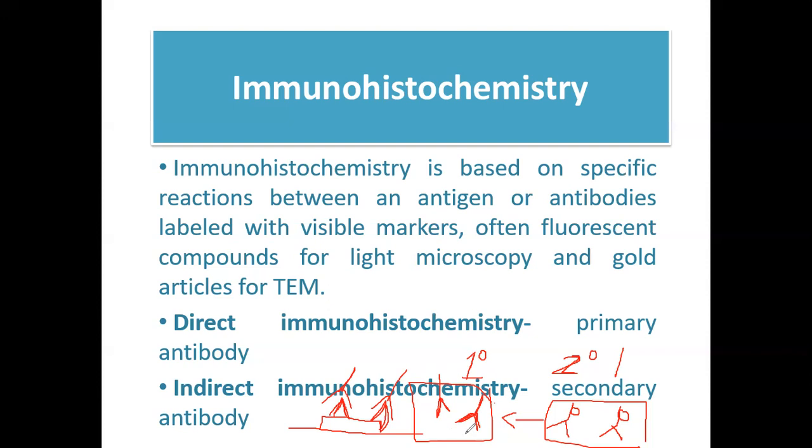So ulitin ko guys ha. These primary antibodies are directed against your antigen of interest. If this is, for example, antigen A, then these primary antibodies are your anti-A antibodies. Your secondary antibody naman, on the other hand, is directed against your primary antibody.